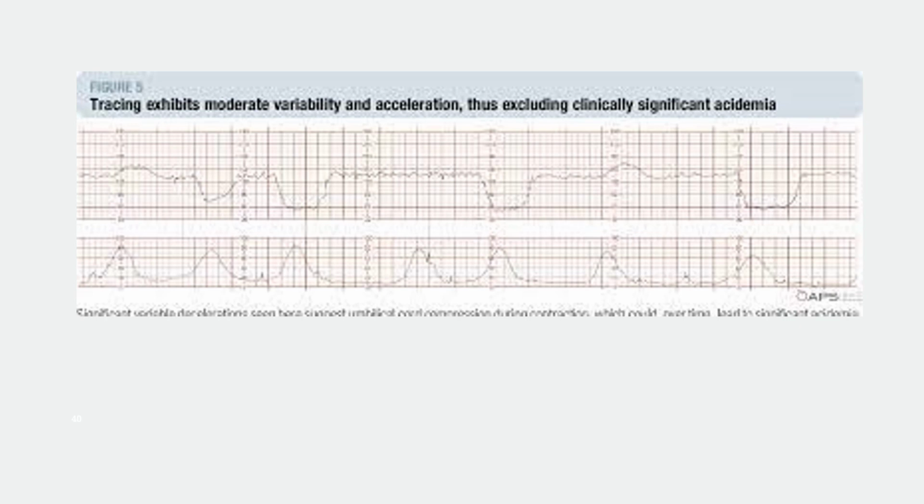If this patient is a multiparous patient, we know they're going to go a little faster than a primip, okay? If she's 8 centimeters and she's a multip, I know she's going to deliver soon. But if she's only a primigravida, her first baby, and she's 4 centimeters and she's doing this, she's probably less likely to make it. And if we can't correct these decelerations, she's probably going to get a cesarean. Okay, so see the difference?